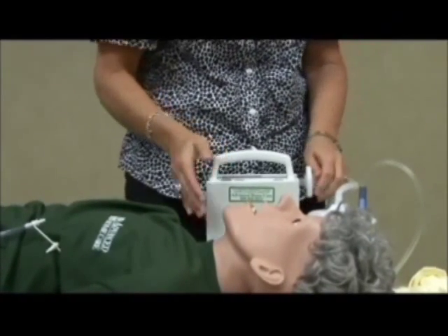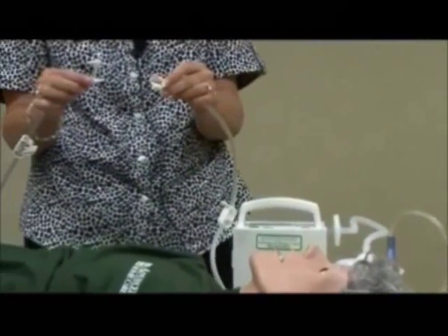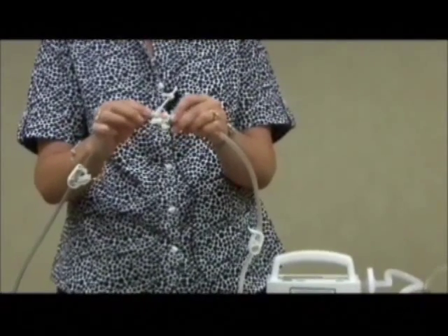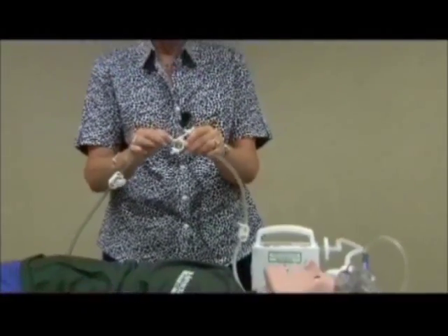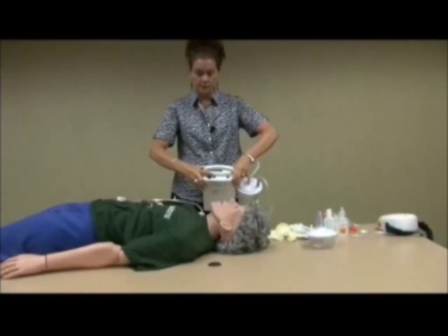Once you've attached the bacteriostatic filter, you're ready to attach the tubing from the canister to your dressing. You'll just put these two together with an audible click. Now you're ready to turn your machine back on by pressing the center button.